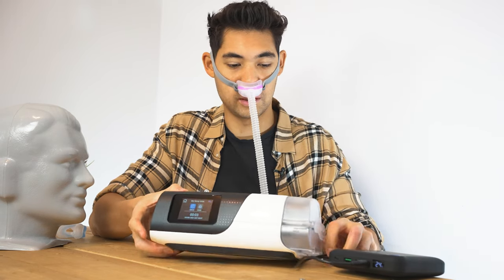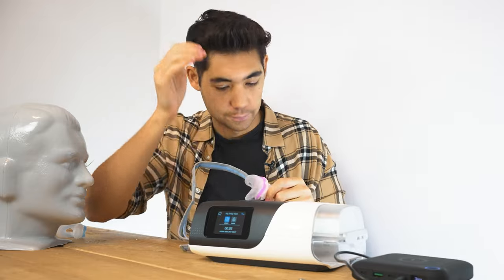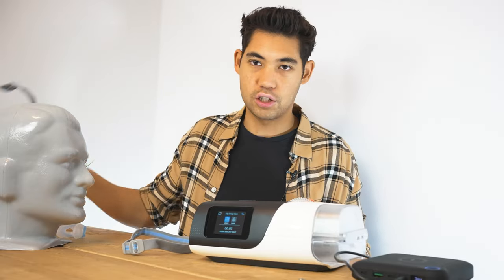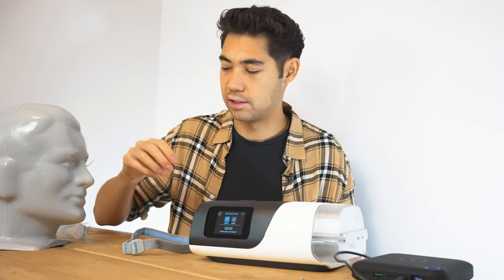You might be able to hear it a little bit — hopefully not — because this mask is known for being one of the quietest masks on the market, and it definitely doesn't disappoint. It is extremely quiet. It's pretty much as quiet as the P10; both are pretty similar.